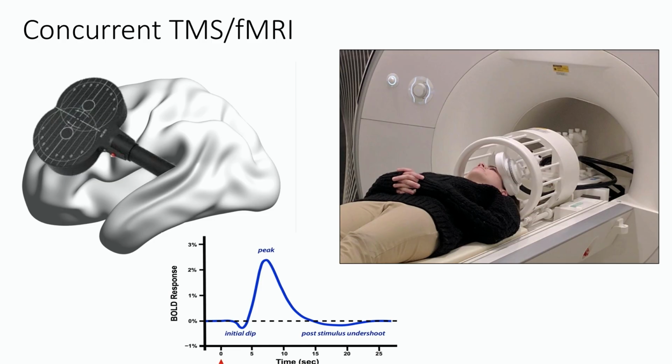What's really nice in our particular application of fMRI is that the BOLD response is slow, right? So we can ping between acquisitions, between readouts, between the TRs. We can put a little gap in there between them. We can ping the circuit without corrupting the image at all, turn on the recording, and capture the evoked response in the brain. It's very clean, very simple. It's a ping of the circuit. It's mapping the circuit with single pulses. It's not the modulation part yet, right?